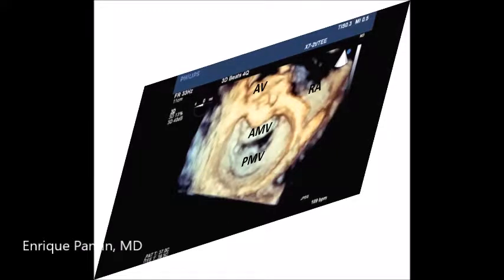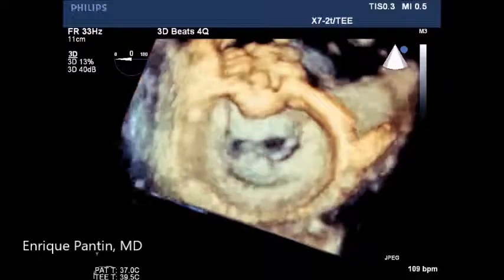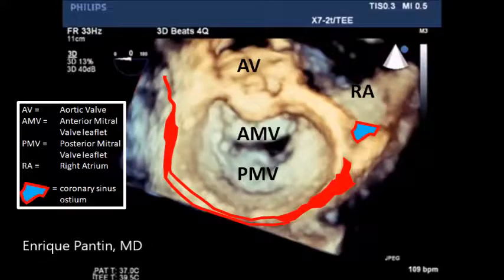Our heart is slightly tilted to the right side of the patient. This is the surgeon's view — the 3D surgical view — a reconstruction from the ultrasound imaging. Note at the top the aortic valve, severely calcified, the anterior mitral valve leaflet, and the posterior mitral valve leaflet.